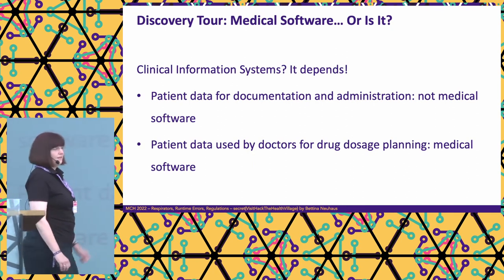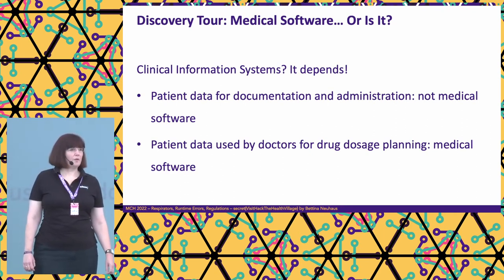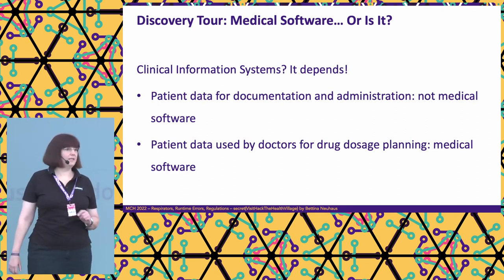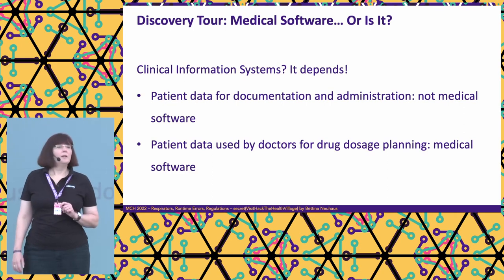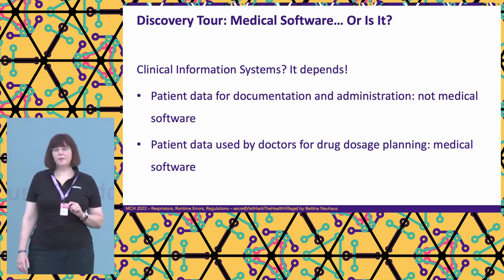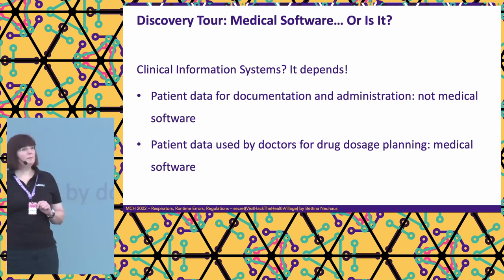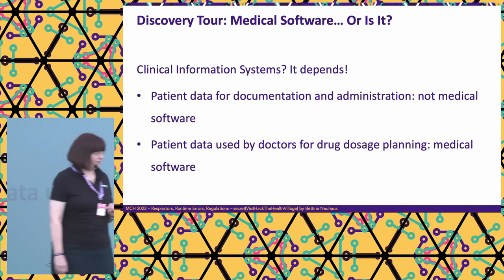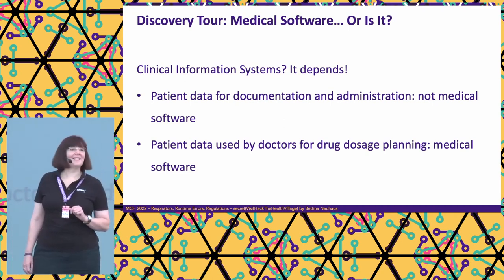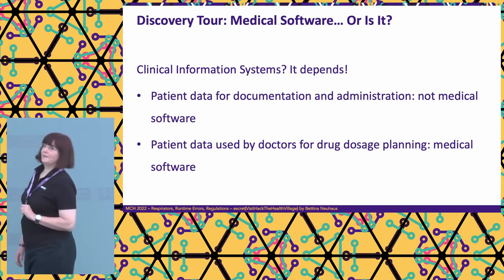And then we have the cases of doubt. For example, clinical information systems. Those are the systems that run in hospitals, and some of them try to cover everything from administrative tasks, so getting the patient data, where is that patient, in what room, and so on, but also diagnostic info. And here's the grayscale. If it's, for example, software that focuses more on the diagnostic part, then it may most probably be a medical product and needs to be regulated. Of course, there is a lot of discussion, and the manufacturers are often not so happy when they are told this is a medical product, you need to get certified, because that means a lot of time and money, but also a lot of safety.